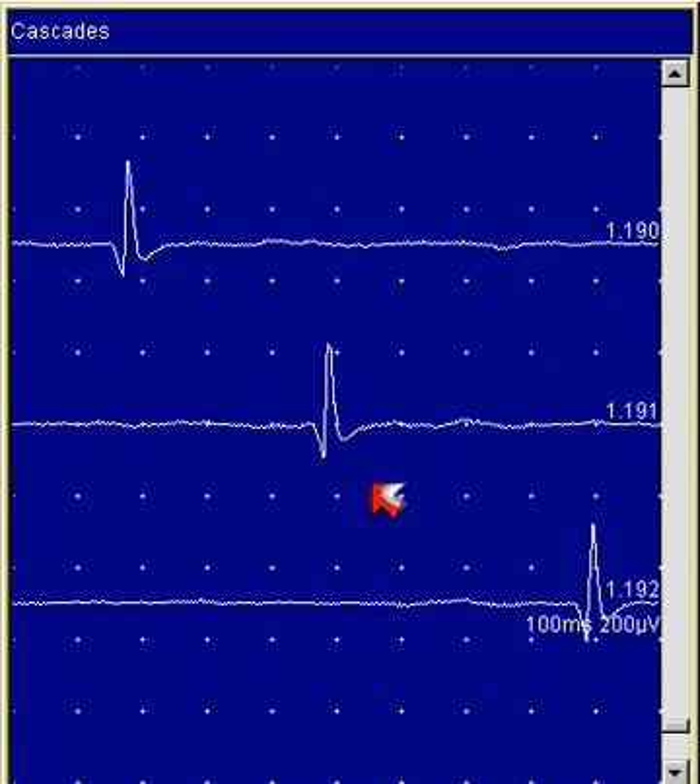Regardless, this is a simple motor unit action potential. The rule is that if the number of phases is four or less, the MUP is called simple.